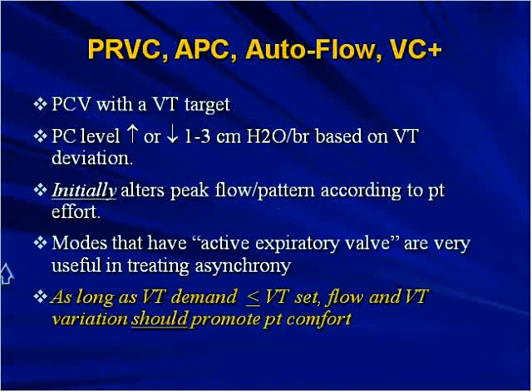And one of the advantages of this mode, some ventilators have it, some don't, is the active expiratory valve, which is actually a wonderful feature for asynchrony. But the problem with this is the floating pressure control level is used as a way to keep tidal volume at a target, and it always assumes that when tidal volume exceeds the target, the lung compliance must be improving, therefore it decreases the pressure control level.